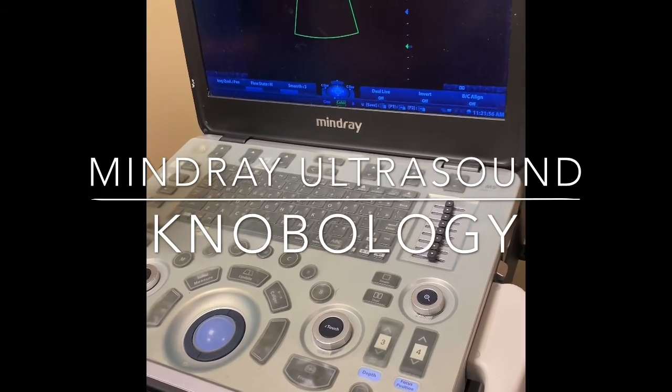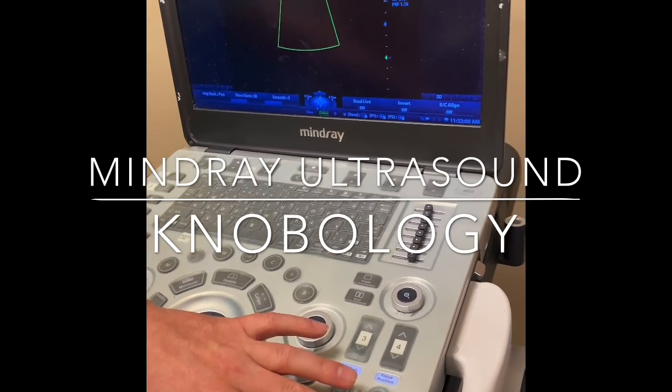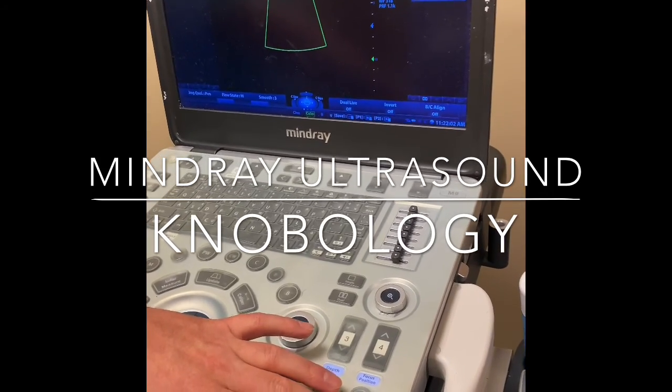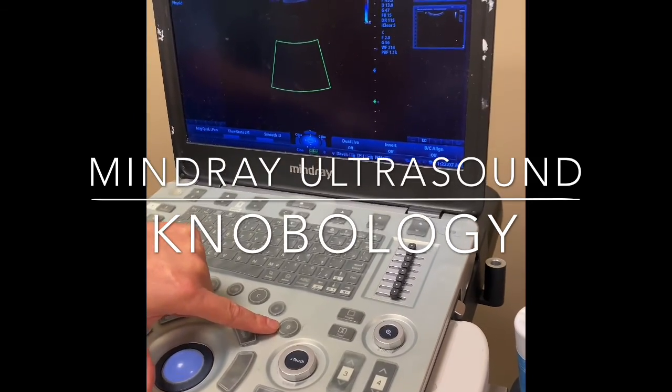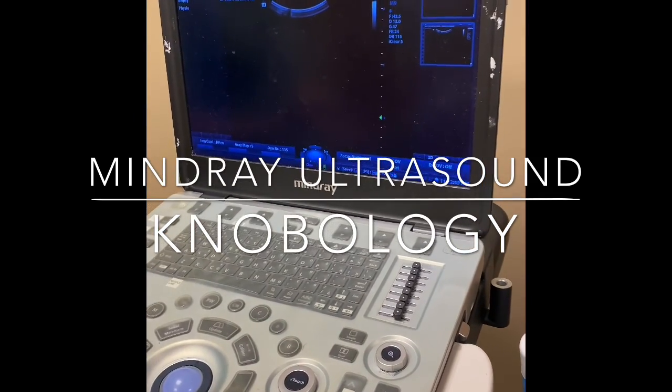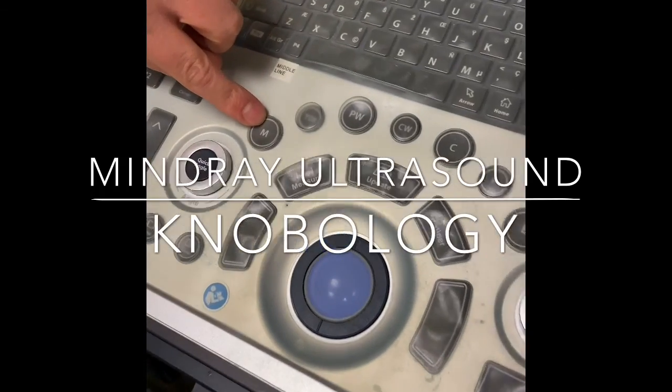When you're done using color flow, you can either save a still image or a clip with a color flow. Typically, clips are more helpful in this case. When you want to resume normal scanning, you can again click B mode or brightness mode to go to the normal scanning mode. Another helpful function is called M mode.